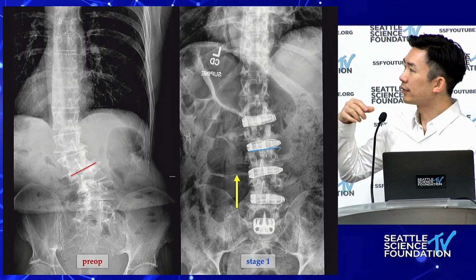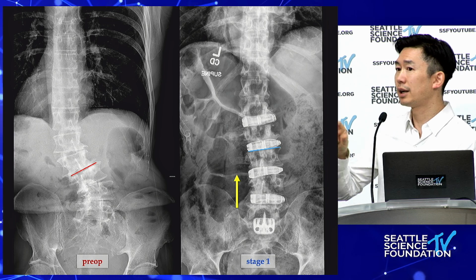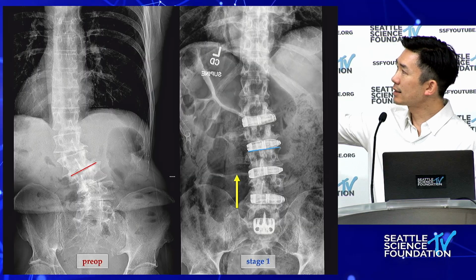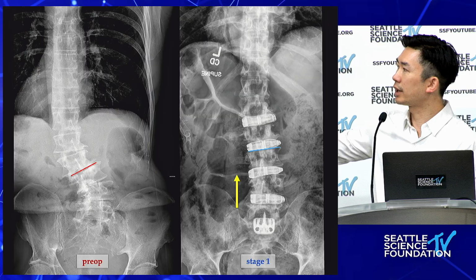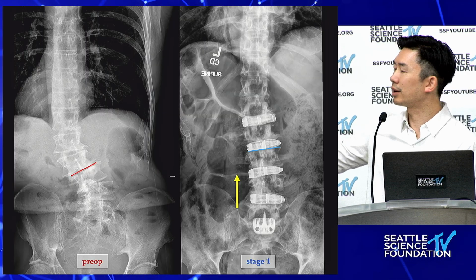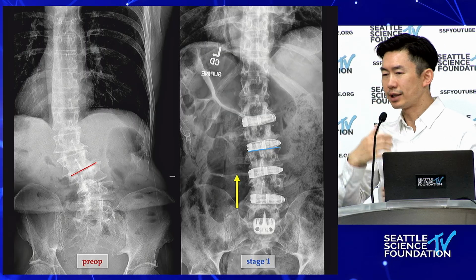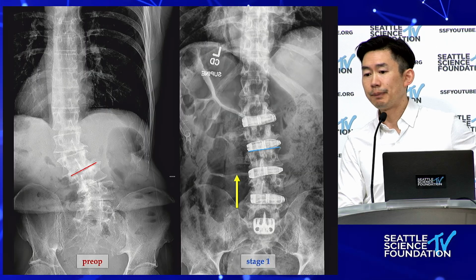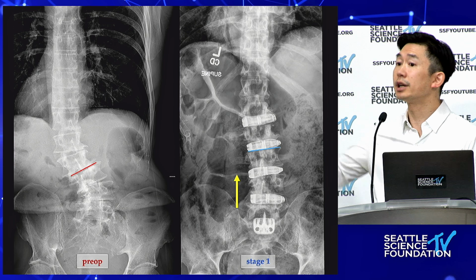And this has been a learning curve because I've been telling him to make that downside taller and taller over time. What I did here, actually, I accessed L1 to L5 with K-wires, but I think in this case I might have done the bottom ones first, if I remember. I did about type C last week where I did that. So I accessed everything with the K-wires, and then I did the lower curves first, right? That way I would see if I got the correction before I actually committed.